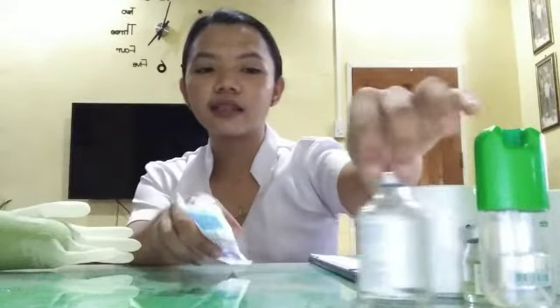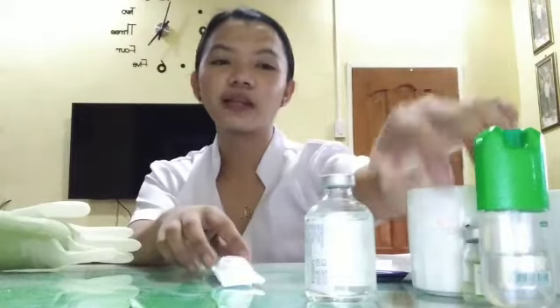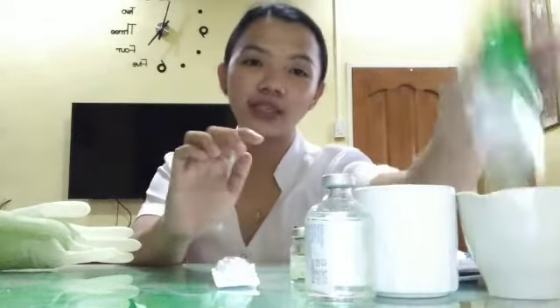We will verify and assess the patient's history of allergic drugs or allergic substances, and then we will assemble our equipments: the needle, the drug, which we will get from the medication box. And then we will perform hand hygiene.